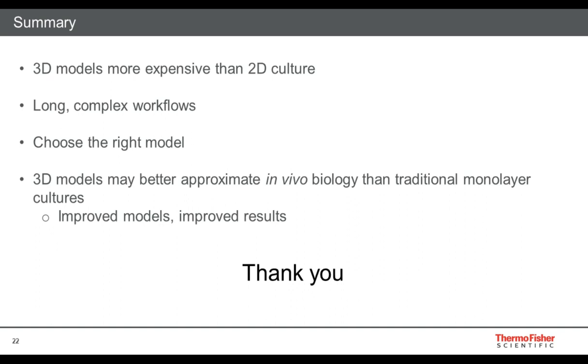Now, it is possible in some situations, if you configure the right growth media, to add in some of the missing cell types. But the pluripotent stem cell models are sort of able to generate more of these cell types, perhaps simultaneously, given the right culture conditions.